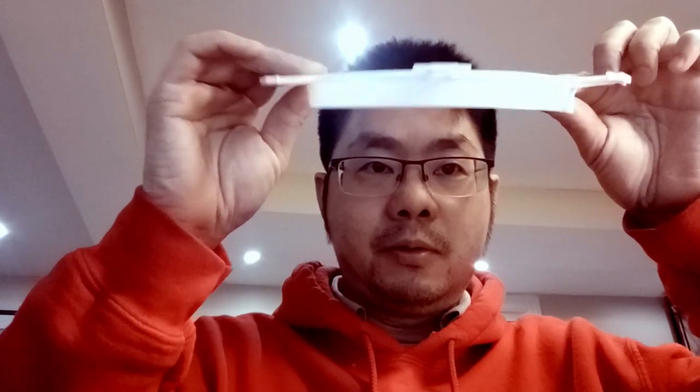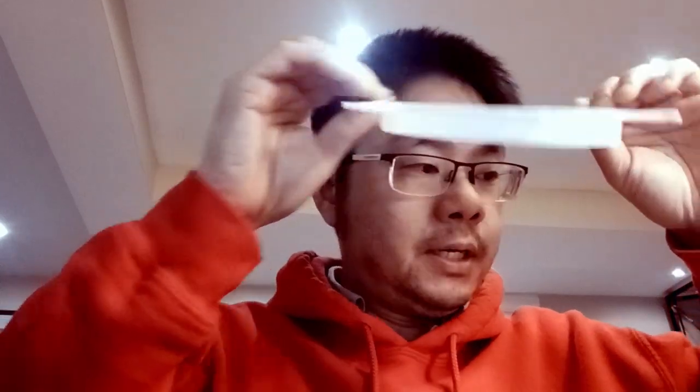I'm just going to do a quick video on how to assemble one of the 3D printed visors that we have on our website. So you take the 3D printed part, and these are meant to attach to a 3-hole punched sheet protector. They already come with the holes on them, but pretty straightforward part.